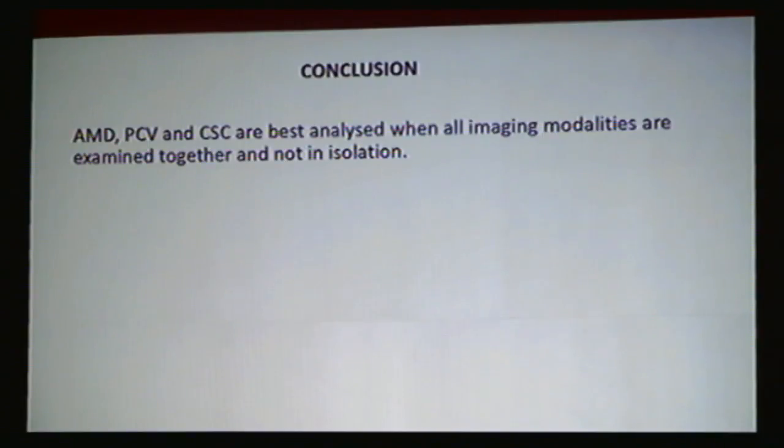So in conclusion, what I'd like to say is, because we have multimodal imaging and so many various technologies to see, the best thing is to put all these images together: FFA, ICG, OCT, autofluorescence, and everything together. Only then will it make sense to analyze the patient and decide on patient management.